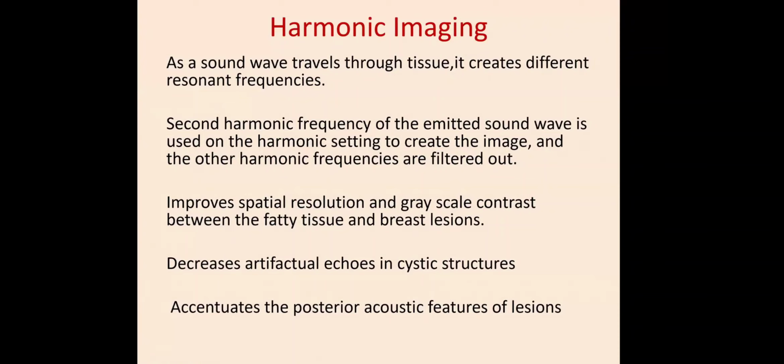So what does it do? Because you filtered out the other multiples of frequencies, you have improved spatial resolution, and your grayscale contrast between the fatty tissue and breast lesions improves. It decreases artifactual echoes in cystic structures, and it accentuates the posterior acoustic features of lesions. So all this will help you in better characterization of the lesions.